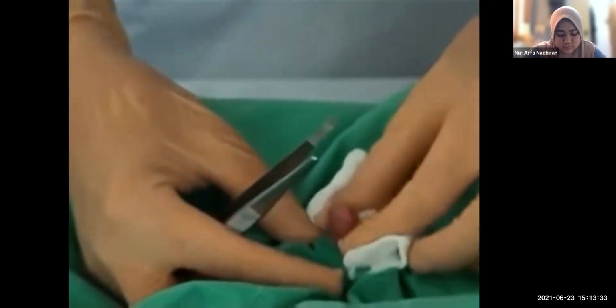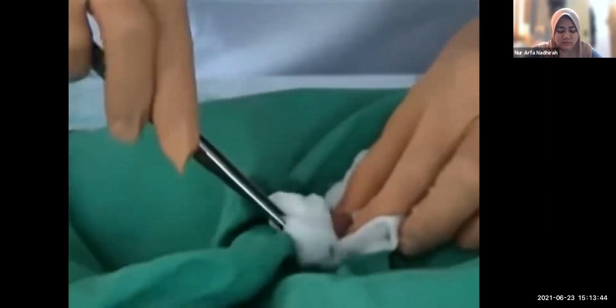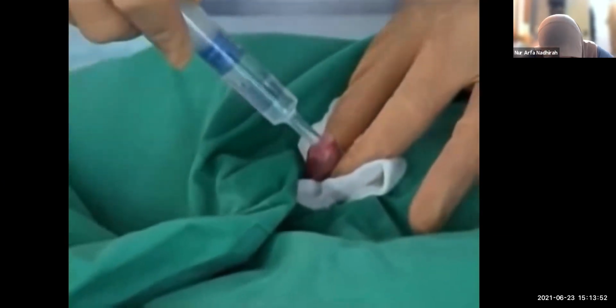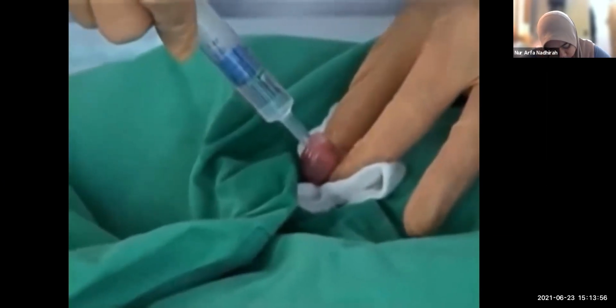A physiologic phimosis is frequently present during childhood, and the foreskin should never be forced to retract. Use the non-dominant hand to hold the penis throughout the procedure. It is considered non-sterile. With your dominant hand, wash the urethral meatus three times using antiseptic soap cotton swabs. At many pediatric centers, lubricant gel is placed on the catheter before the procedure is performed. At some centers, clinicians also insert lubricant into the urethra.